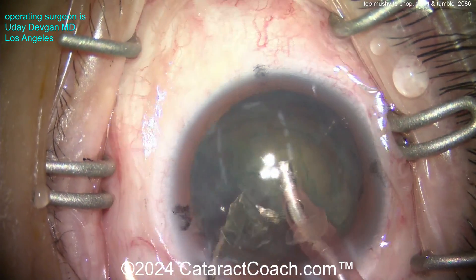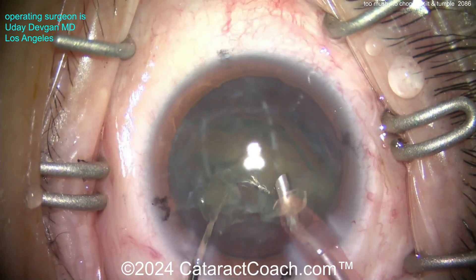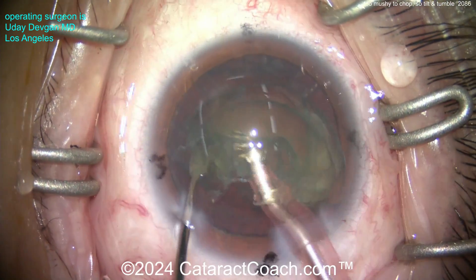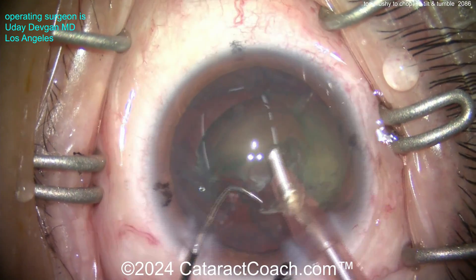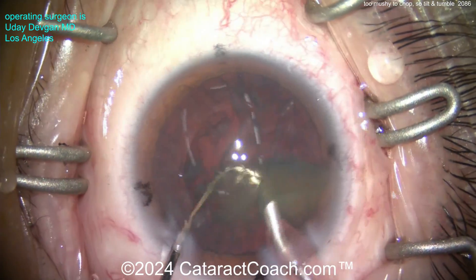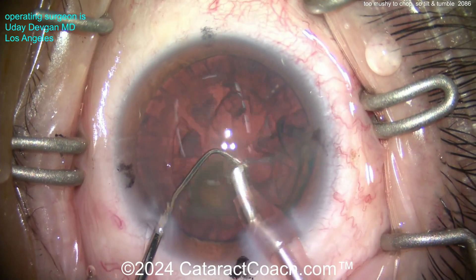That's the last piece - that big chunk of nucleus will come down pretty easily. Using phaco power modulation to minimize phaco energy, like a burst mode or pulse mode, a variable or low duty cycle. And I know you're thinking - what about the cornea? The cornea can be perfectly clear in this patient. We have a good dispersive viscoelastic, and we're not operating at the endothelium - we're down at the iris plane.